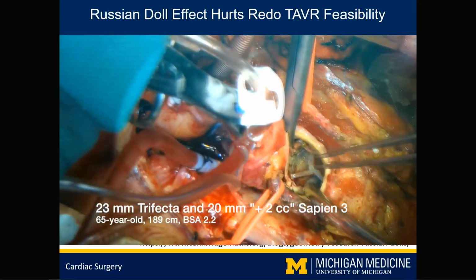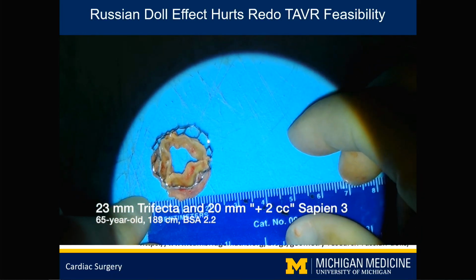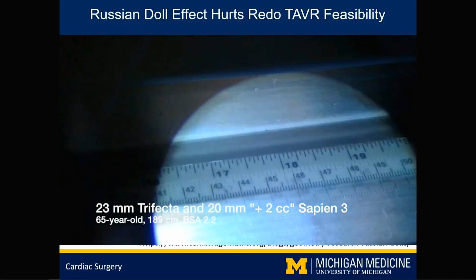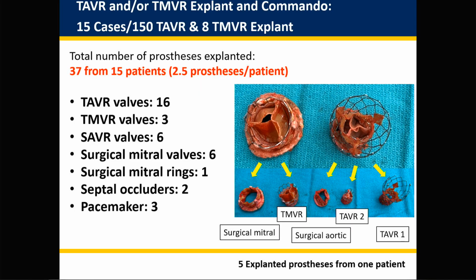This patient is 189 centimeters, BSA 2.2. He received a 20 millimeter SAPIEN inside a 23 Trifecta. And this is happening everywhere now. We've performed the commando procedure in those post-TAVR or post-TMVR patients.